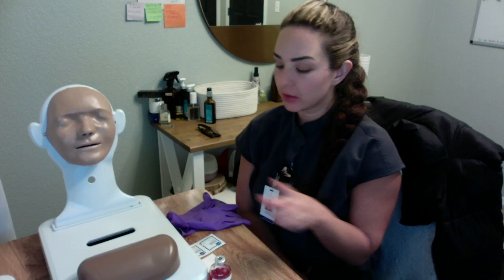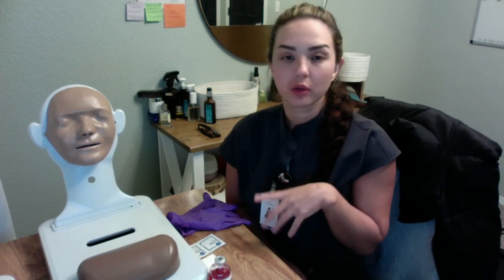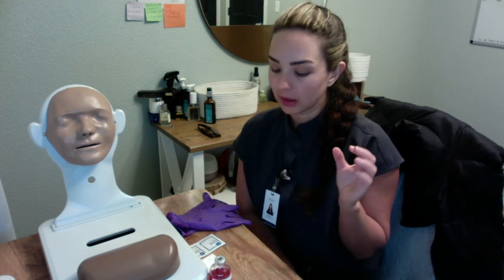Hi, my name is Hunter, and today I will be performing the skill administration of an intradermal medication. For this skill, I have my badge, I've got my school scrubs, no polish, no jewelry, so we'll go ahead and get started. So the first thing we want to do is collect the supplies that we need.